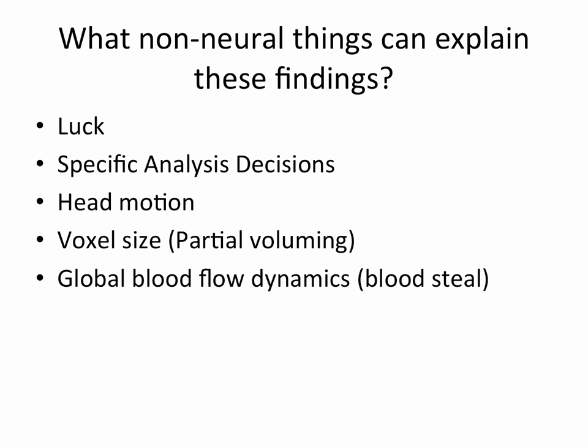For this specific study, there was actually an attention component. It was a flashing checkerboard, and that was for 20 seconds. In every one of those 20-second periods, 4 symbols appeared randomly, and they were either a letter or a number, and the person had to press a key for a letter, key for a number. So it turned out that these volunteers, like I said, these are phenomenal volunteers, were almost perfect at getting this task right. Pretty much in every block and every run, they were getting it.